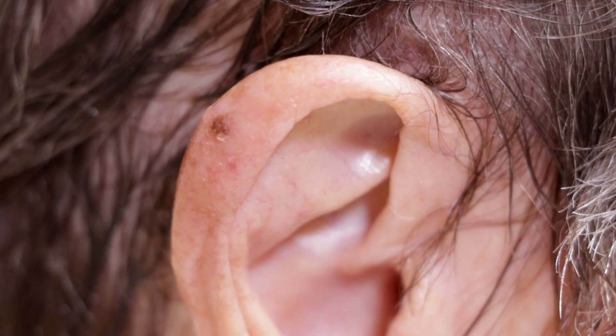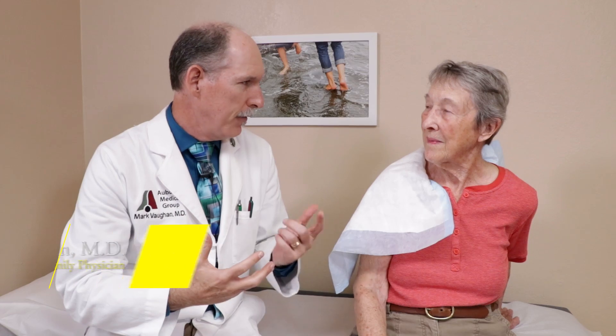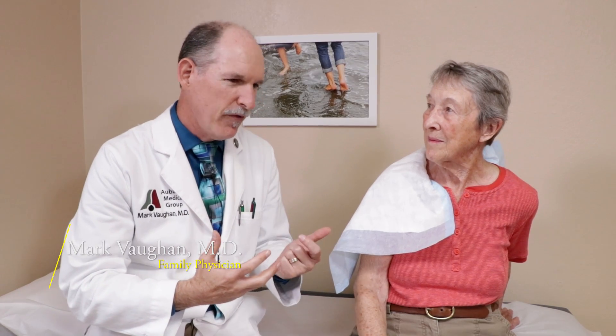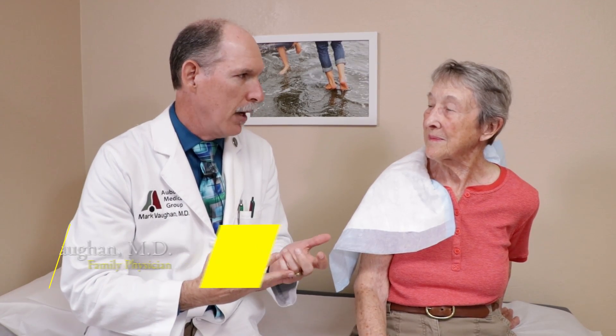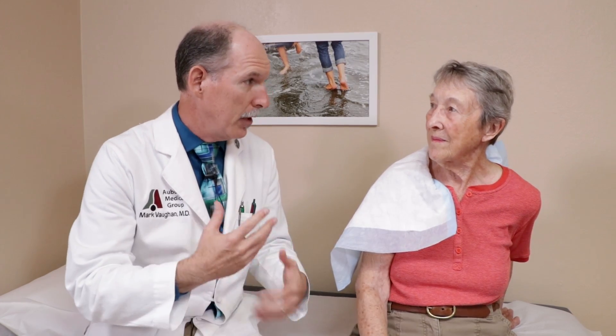We have the choice of doing a punch biopsy or a shave biopsy. My recommendation for this one — because I'm feeling pretty sure it's not a malignant melanoma — is that we would use a shave biopsy. It's a lot easier to do on the ear and easier to recover from and heal from.